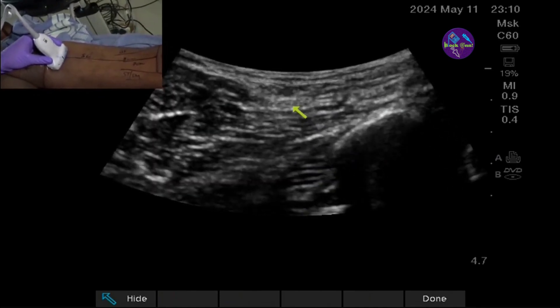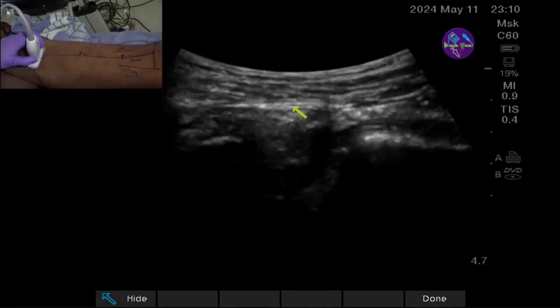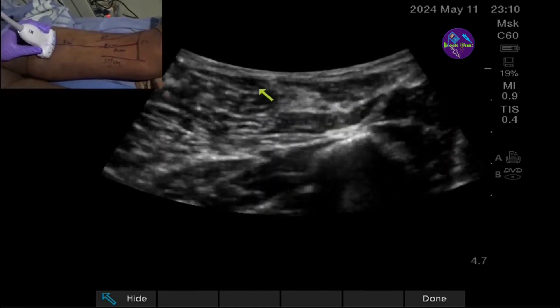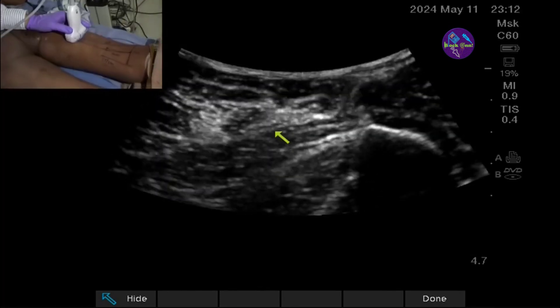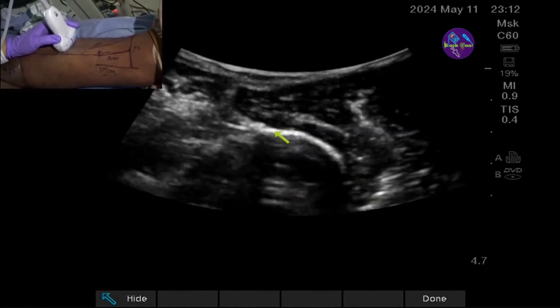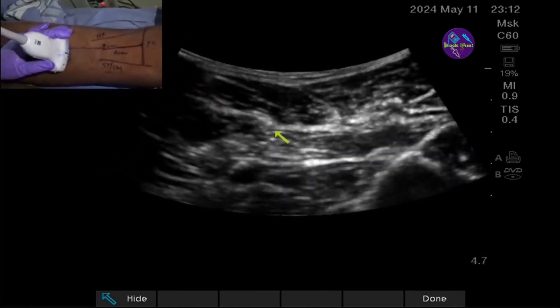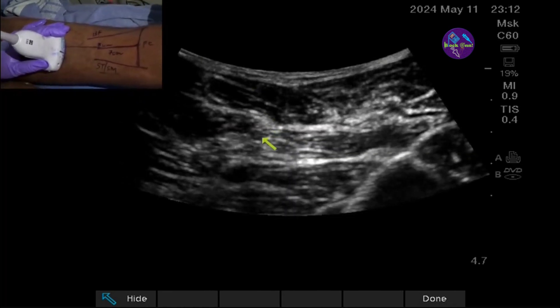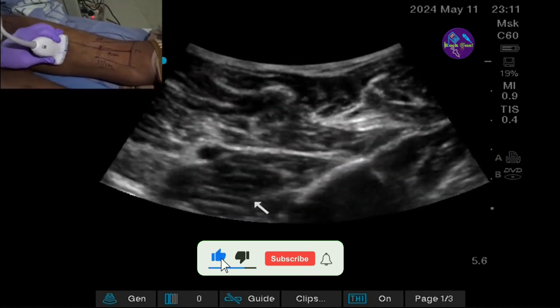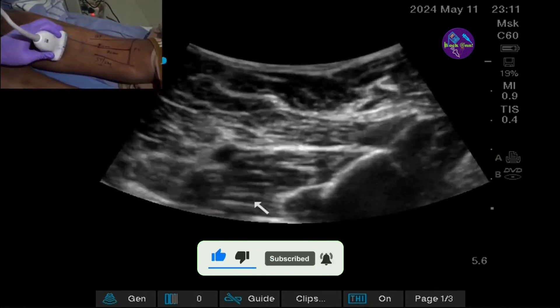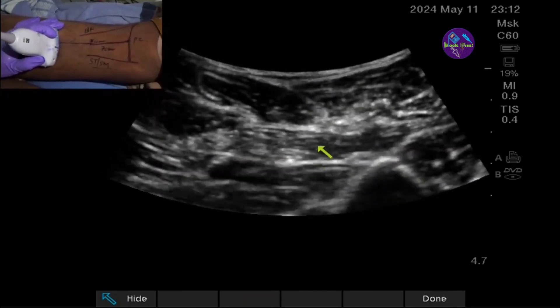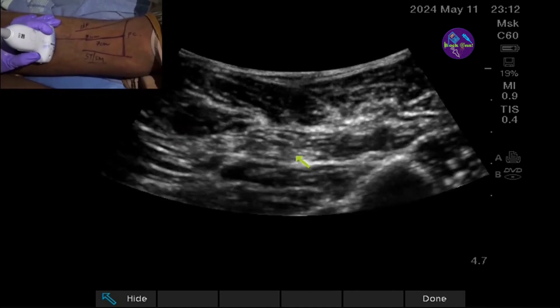As we scan down, the gluteus muscle thins out. Above the sciatic nerve we now see the biceps femoris muscle. Indicator is towards me, so the lateral side shows biceps femoris and beyond that the vastus lateralis. On the medial side you see the semi-tendinosus and semi-membranosus muscles. Interestingly, the adductor canal can also be seen from the posterior side here — the adductor magnus is visible, and tracing further you can identify the adductor canal.